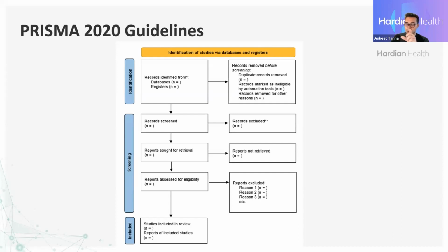And it's not in this screenshot, but there are also additional options to say how you could have come across data which didn't come from a systematic search. So there are provisions, for example, if you want to take a snowballing approach in addition to systematic searches using extensive search strings, you should record those pragmatic papers that you find as well.